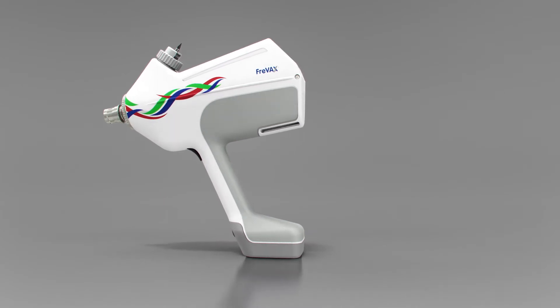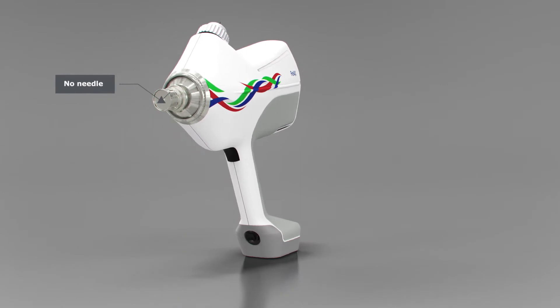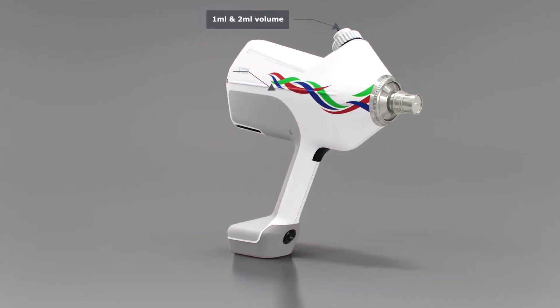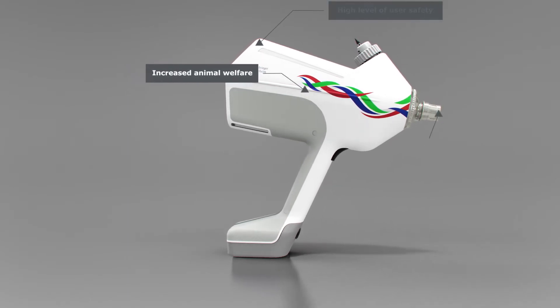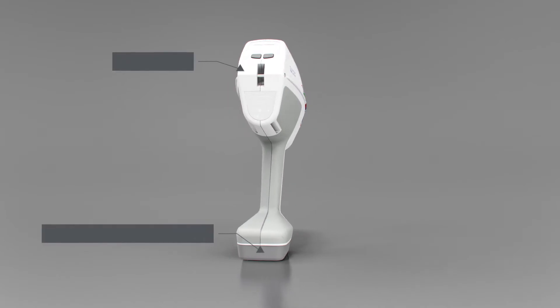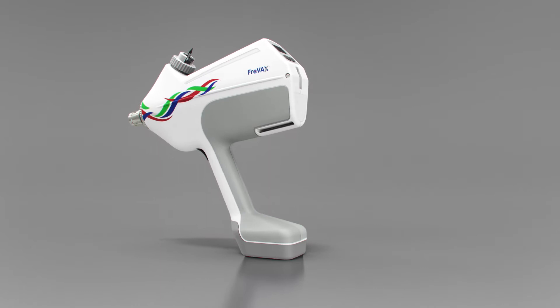Freevax is a smart, needle-free device for intramuscular injection of pigs around weaning until the end of nursery. It offers smooth and painless injections with no recoil, low noise level, and direct feedback for the user through intelligent sensors and LED alerts. Keep calm and inject — the pigs stay relaxed, you stay relaxed.